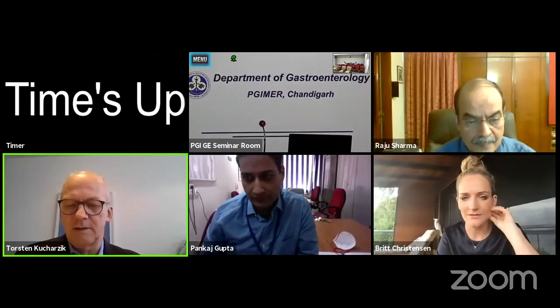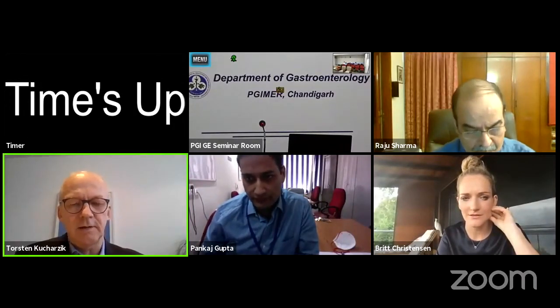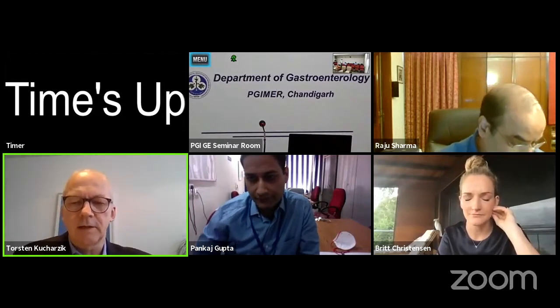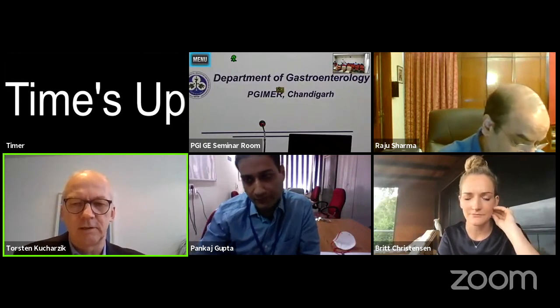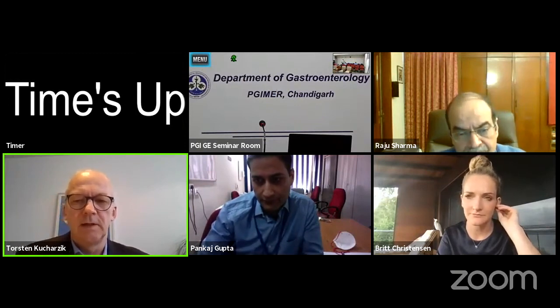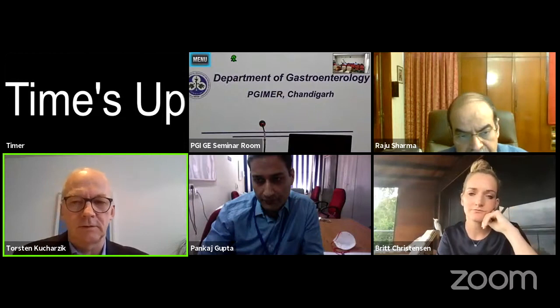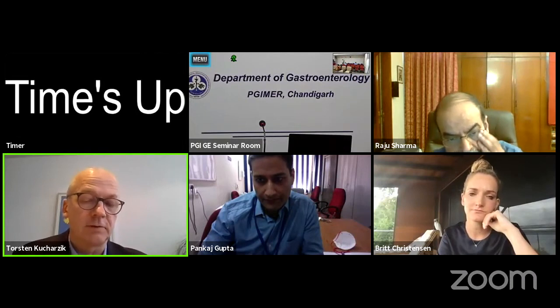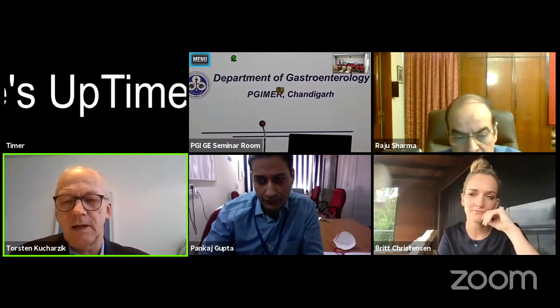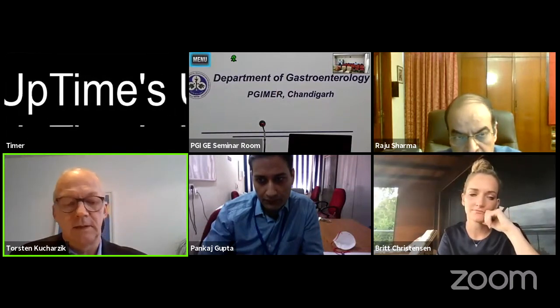I can start. I think it's a good point. In most situations, oral contrast is not required. If you look at small bowel pathology, in particular small bowel strictures, and you don't find them, it is sometimes helpful to use oral contrast. So PEG solution, you can give the patient 250 mils of PEG solution to drink, and then follow up the small bowel, which might increase sensitivity. There are papers published a lot about this, but I think it's not required in all patients.